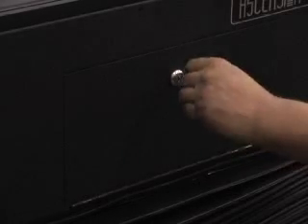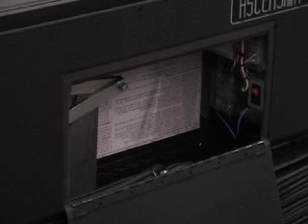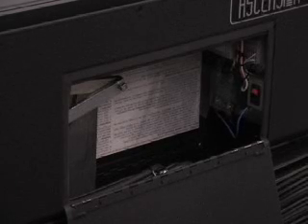the lift on. The on-off switch is located in the left machinery cabinet. Note that the lift can be left on at all times unless your facility needs to restrict the usage of the lift. The lift controls require about 8 seconds to initialize before the lift can be operated. Alternately, if an electrical outlet is not available, skip this step and then use the hand pump to raise or lower the lift car in the following steps.